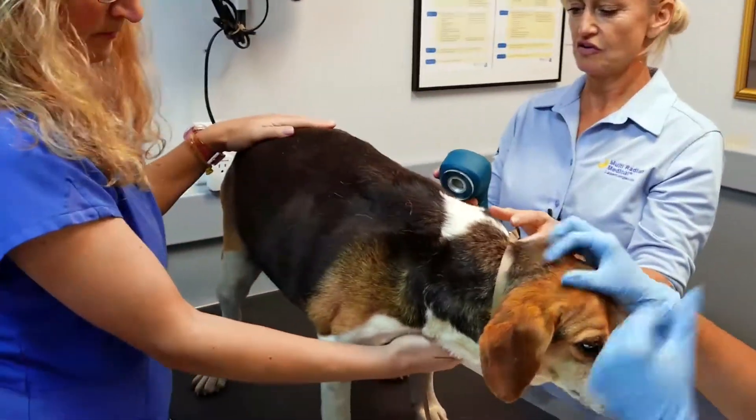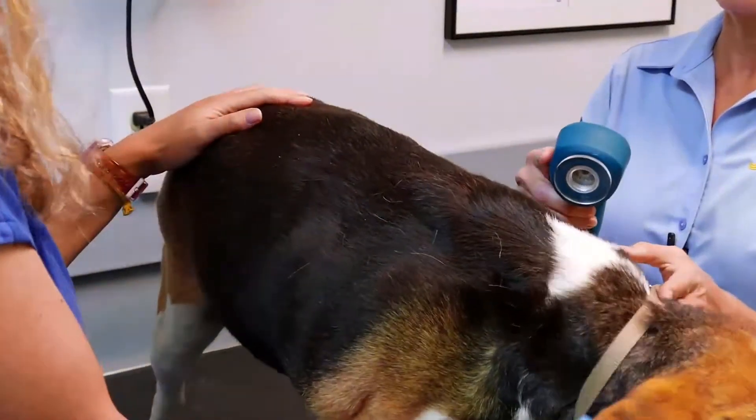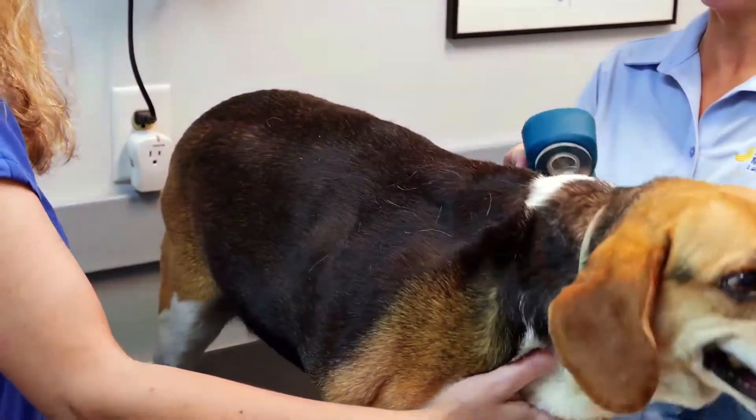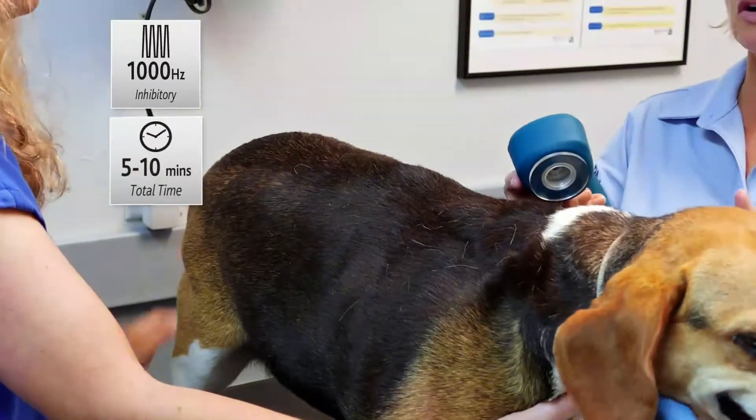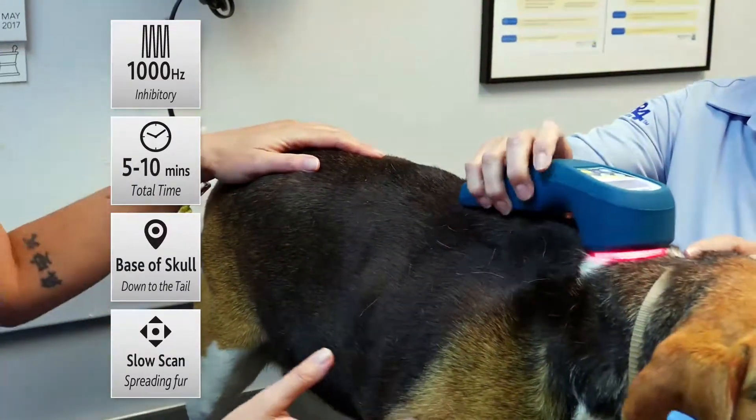For the unwind protocol, 1,000 Hertz. I'm going to set it for 10 minutes. You might not need 10 minutes, but I can always turn it off versus having to turn it back on and her listen to the beep twice.